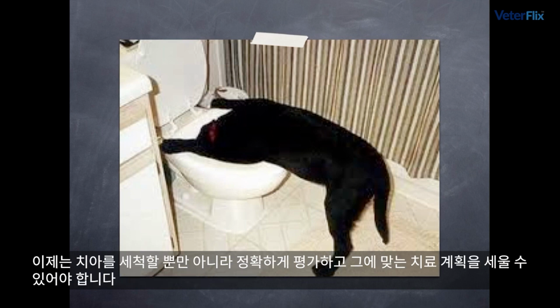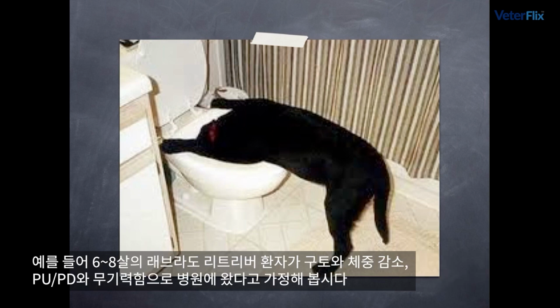And the thinking is we need to not only clean the teeth, but we need to assess properly and apply the appropriate treatment plan. Imagine, if you will, a Labrador Retriever walks into your practice, say 6 to 8 years old, and comes in with the clinical signs of vomiting, weight loss, PUPD, and lethargy.